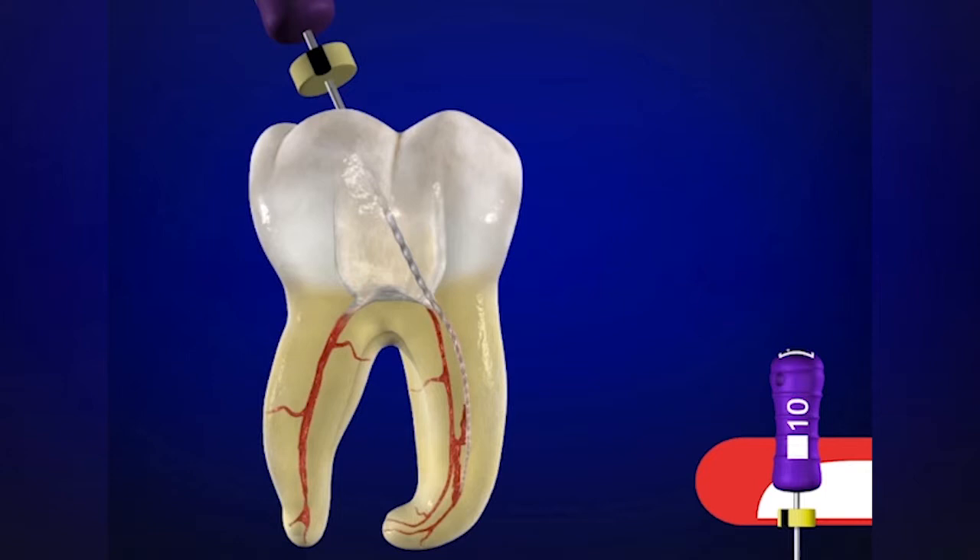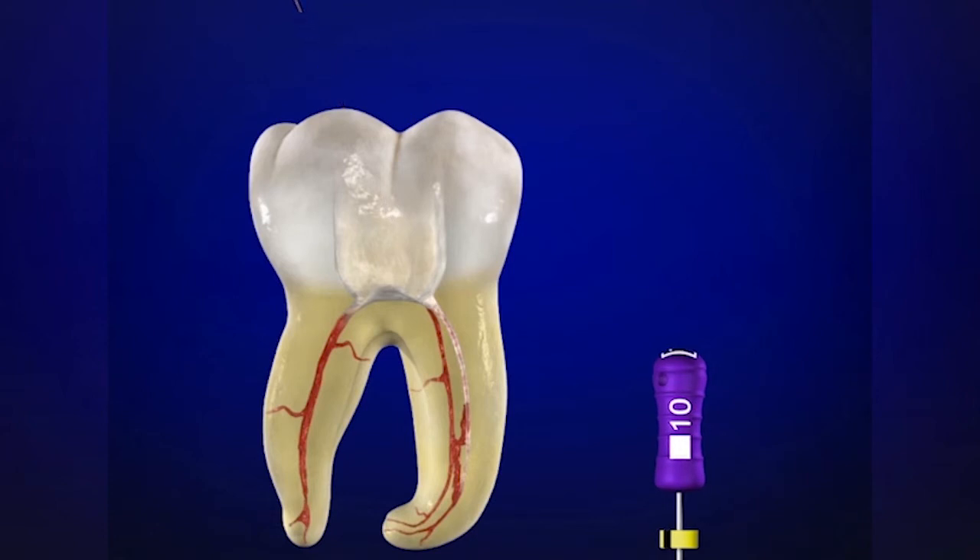Obviously, in shorter, wider, and straighter canals the instrument may want to go to length. But the handle is off-axis, so we're not going to navigate the curvature with as much competency and integrity as if we had the handle uprighted. In these instances, just take what the canal will give you, push the stop down so we know the maximum depth where the file can be easily placed, and work it up and down with little short amplitude strokes — refining, smoothing, and expanding the glide path. This instrument can then be removed, and we can place the working length on this file and transfer it onto Shaper X.